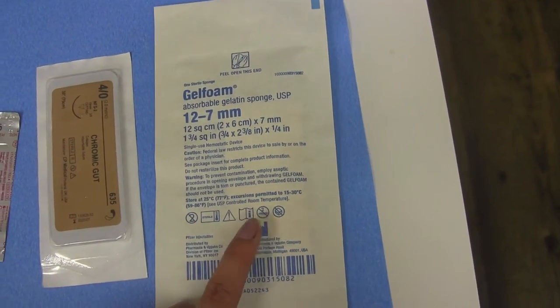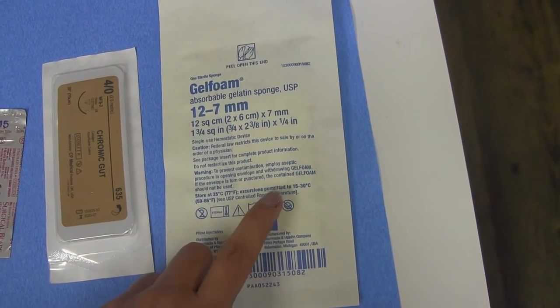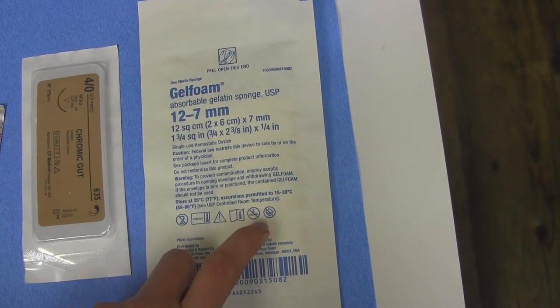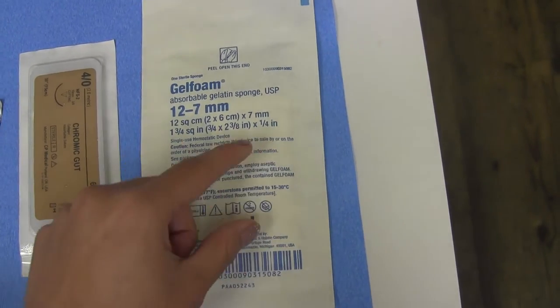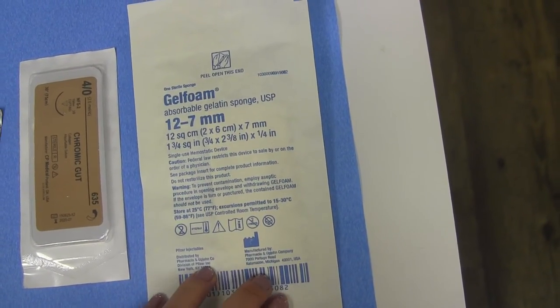The gel foam we will use to help with hemostasis. After an extraction, we will place the gel foam inside the extraction site so that the patient can start clotting. We will often try to use all of the gel foam because once we open it, we can't really save it for another patient.